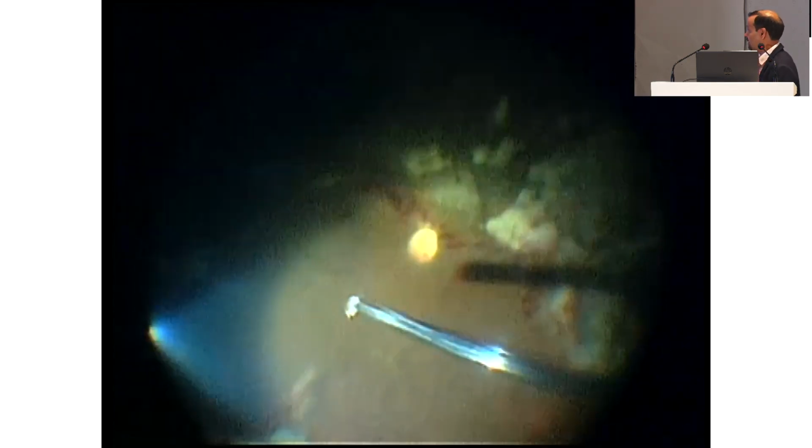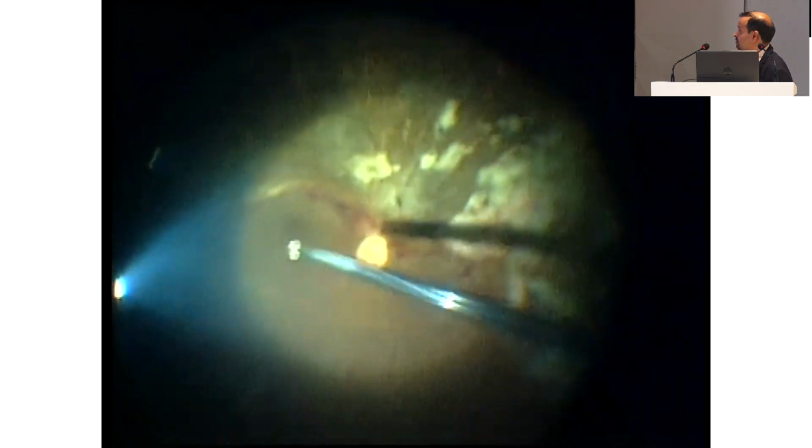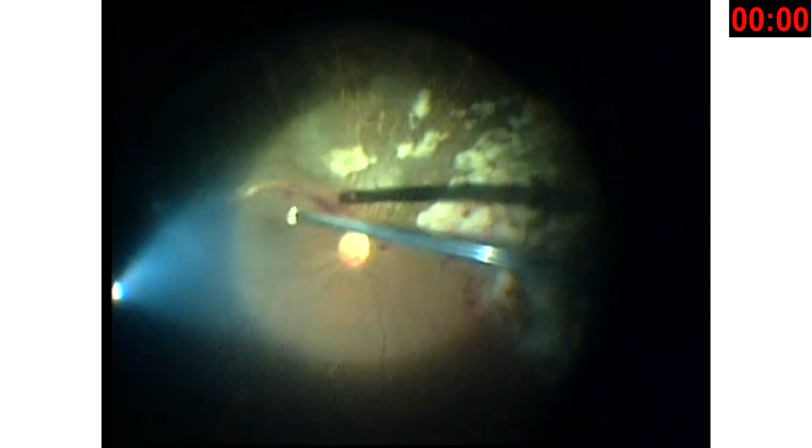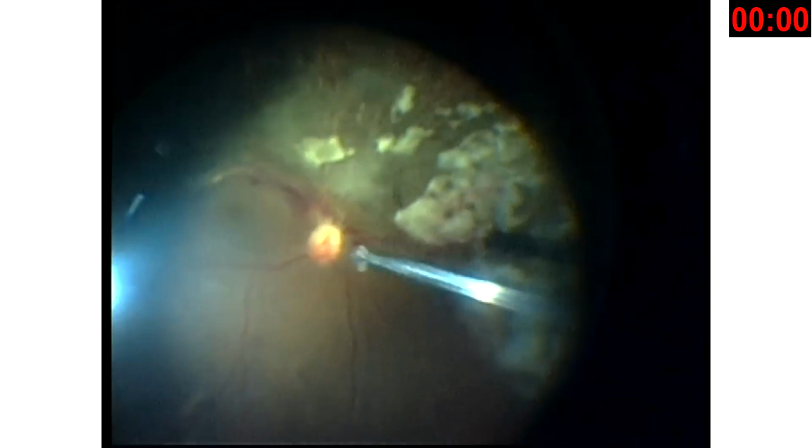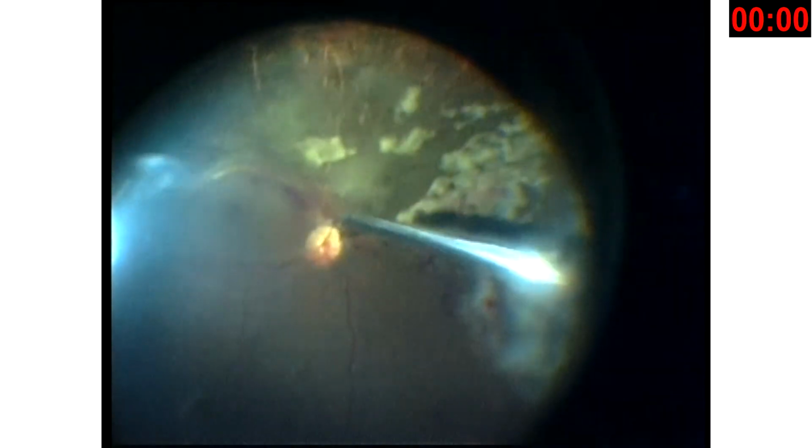I'll just show you one case quickly. This is a patient with CMV retinitis with retinal detachment. As Dr. Rohan showed, there is vitreous which is quite membranous, but in this patient I was able to induce a PVD. You can see the vitreous is quite hazy, and that is a boon in a way. You do not need triamcinolone, and it becomes membranous. As you can see, there are some membranes.